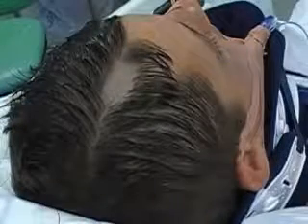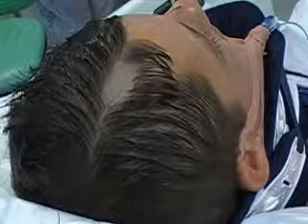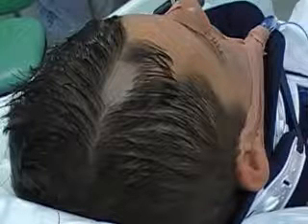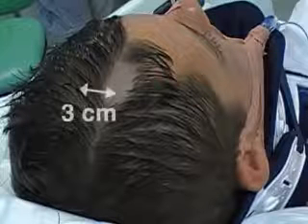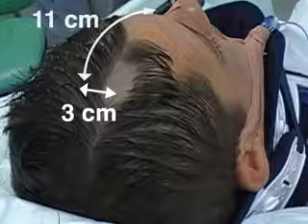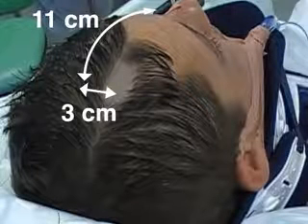Generally, ICP monitors are inserted on the side of the non-dominant hemisphere, which is usually the right side. The incision is made along the mid-pupillary line, 3 cm lateral to the midline to avoid the sagittal sinus, approximately 11 cm posterior to the nasion, and at least 1 cm anterior to the coronal suture to avoid the motor strip.